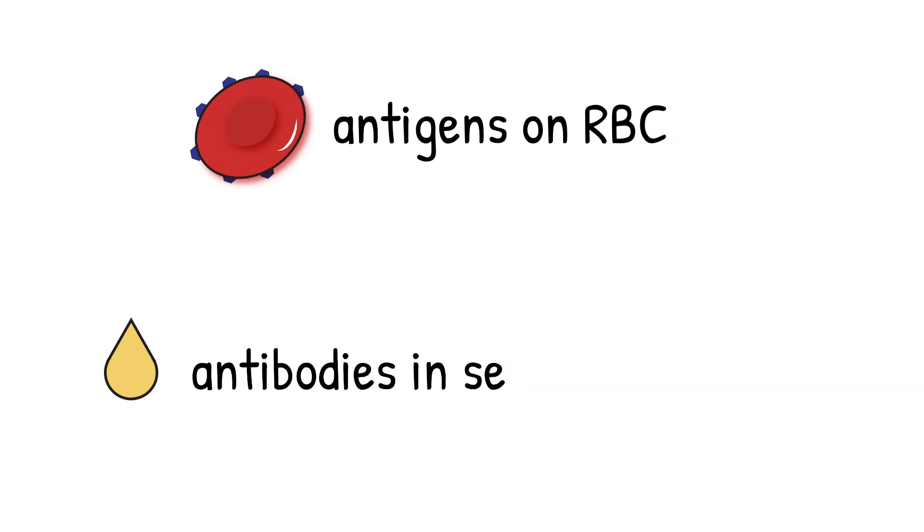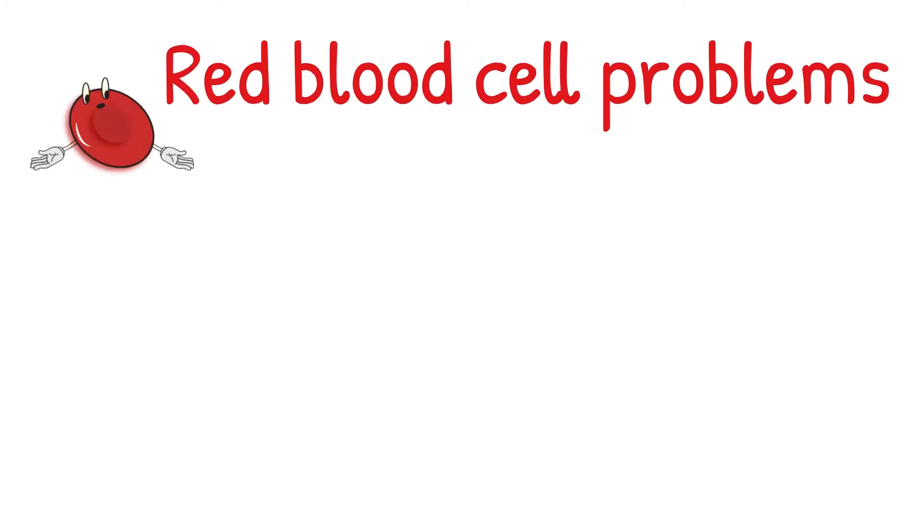If you keep these two things straight, then you will have an easier time understanding this concept. Antigens on red blood cells, antibodies in serums or plasma. Let's start with red blood cell problem. Red blood cell problem is when the red blood cells give an unexpected result. This can happen for many reasons.